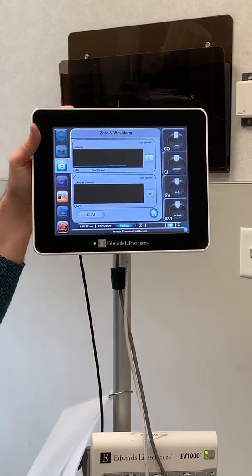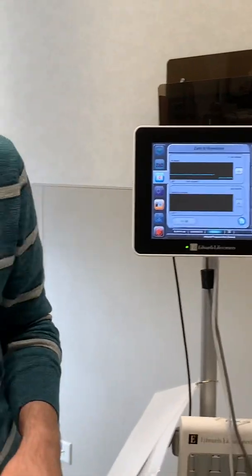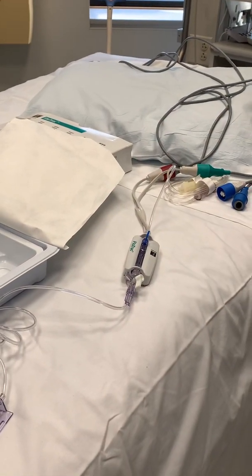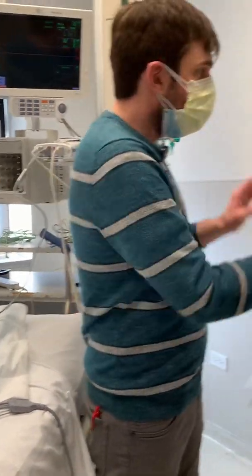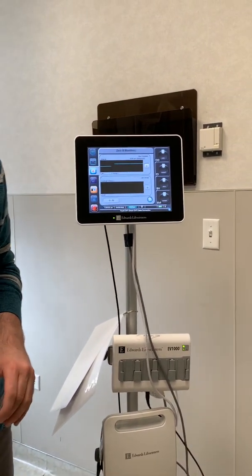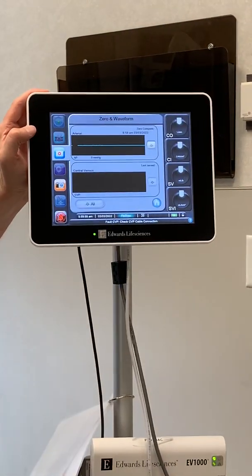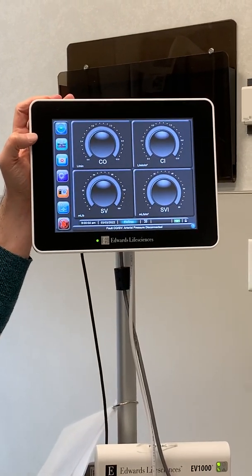It's going to take you into the zero waveform screen, and then all you have to do is go back to your transducer, open your transducer up to air, and then you can zero it on the bedside monitor and hit zero here just by hitting the zero button. It says zero complete. Open your transducer back up, hit the home button, and now you should be getting your values.